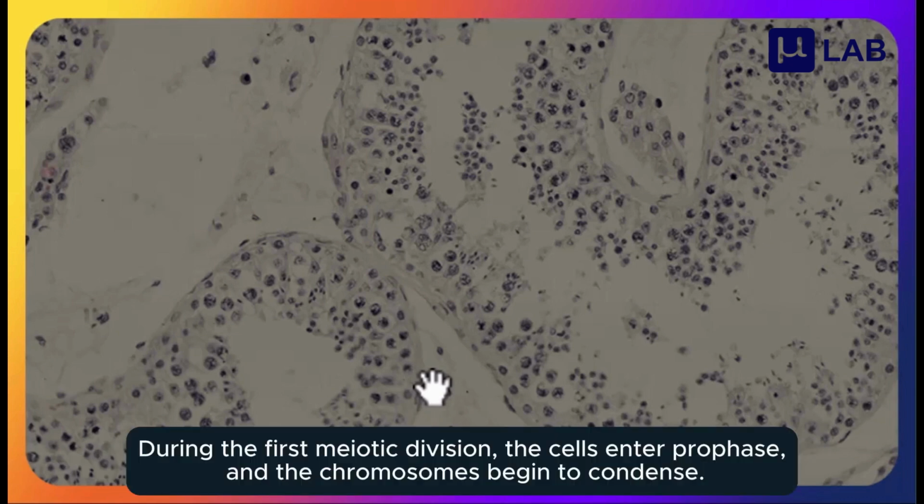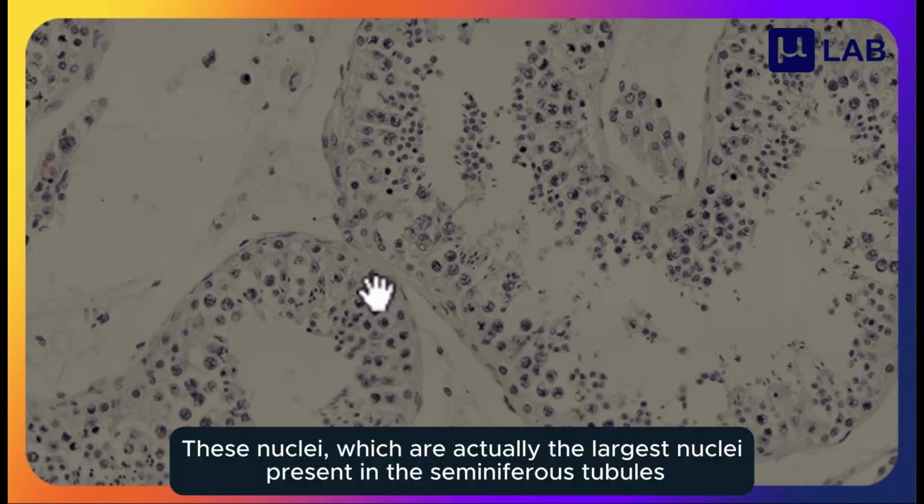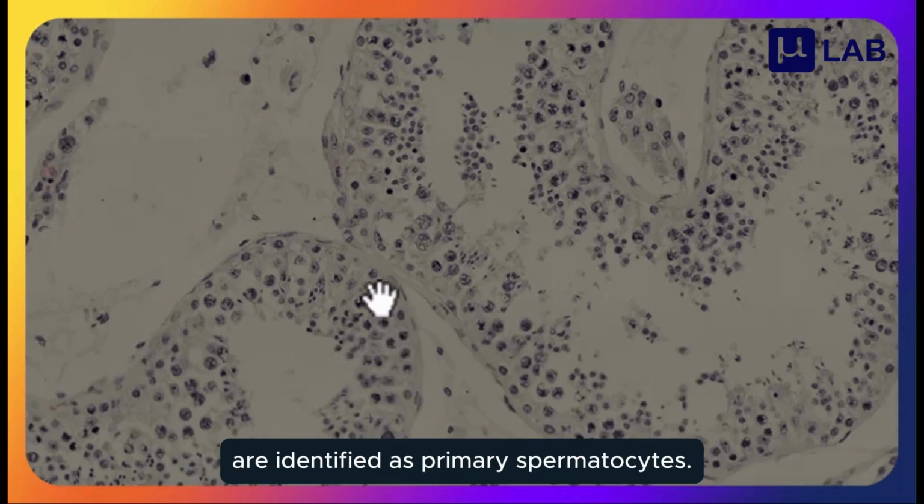During the first meiotic division, the cells enter prophase, and the chromosomes begin to condense. From this point on, this cell is referred to as a primary spermatocyte. These nuclei, which are actually the largest nuclei present in the seminiferous tubules, are identified as primary spermatocytes.